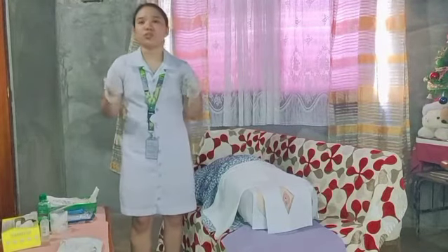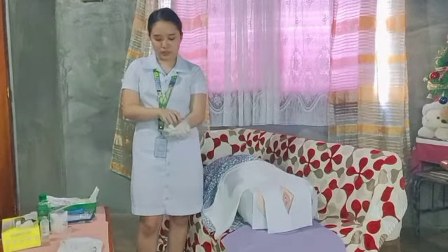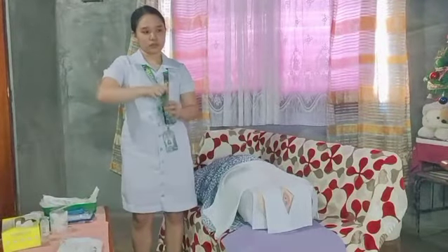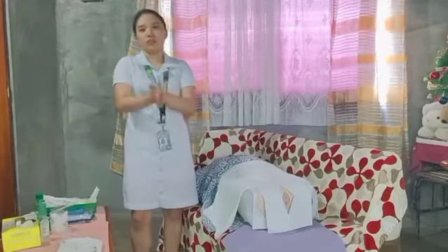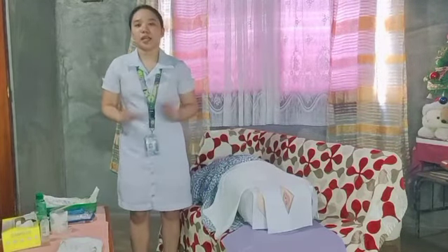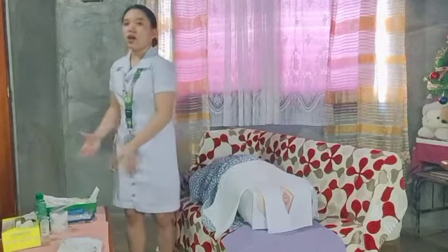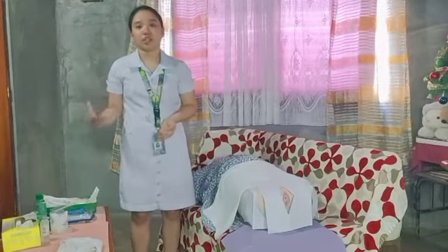Now we are going to remove the gloves and do hand hygiene and open the catheterization kit. Okay. The rationale: these steps ensure preparation and organization for the procedure, and it will also maximize time and effort. So as you can see, we have opened the catheterization kit, and we will now apply sterile gloves using sterile-to-sterile technique.